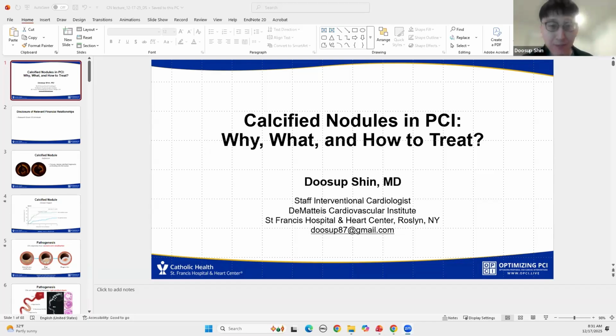Yeah, so your question was specifically on the reprotrusion cases, right? For example, ISR due to calcium. That's actually a very good question, and we know that if there's ISR because of reprotrusion of a calcified nodule, the prognosis is probably the worst. They tend not to do well no matter what you do. So first of all, I think it's important to prep as much as possible before you place the first stent. However, as I showed, it's not uncommon to have reprotrusion of the material through the stent.